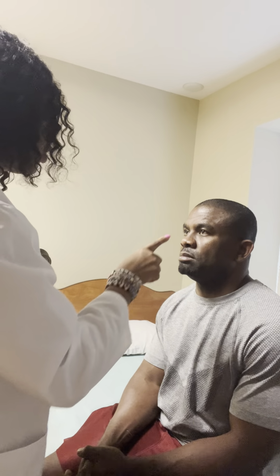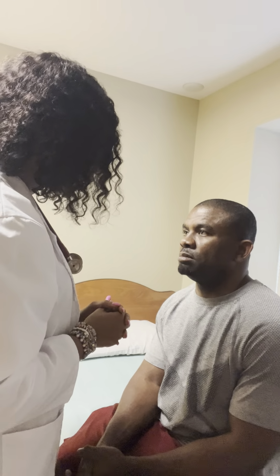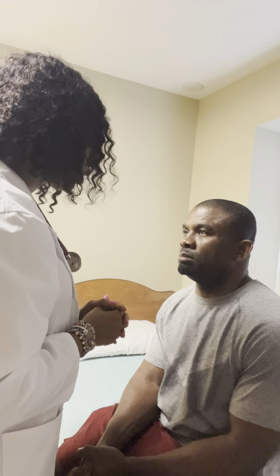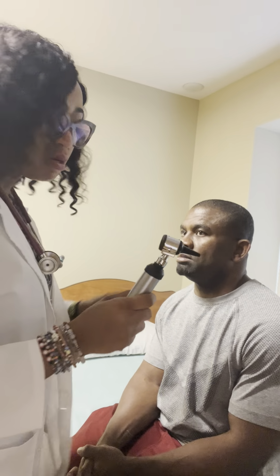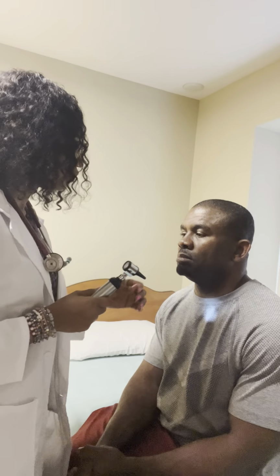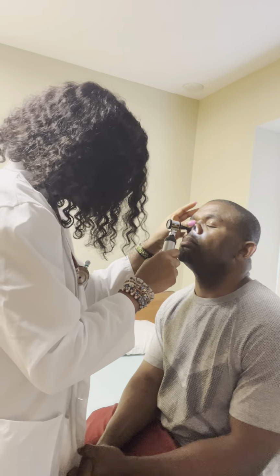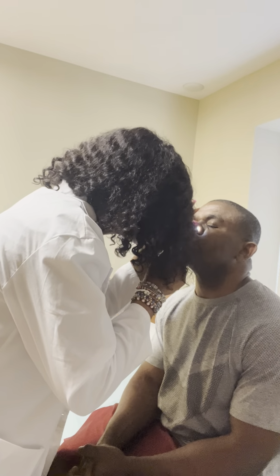Next, I'll be assessing the nose, looking for any obvious fracture. I don't see any fracture. The nose is midline, and I don't see any swelling or lesion. I'll use my otoscope and look inside the nose. I will tip the nose up and check the left turbinate, which is pink, clear and moist.